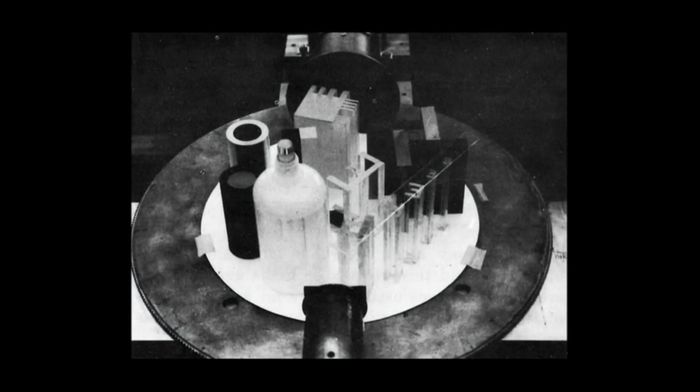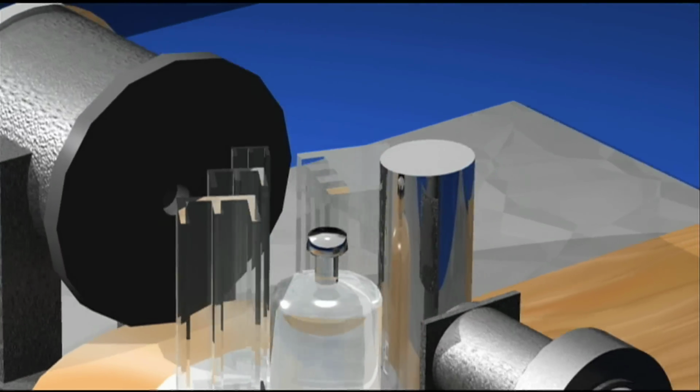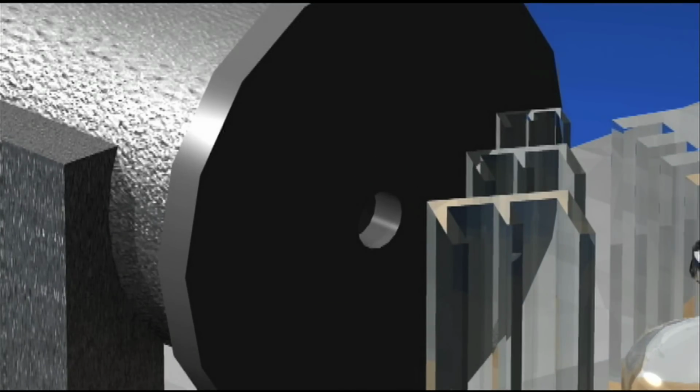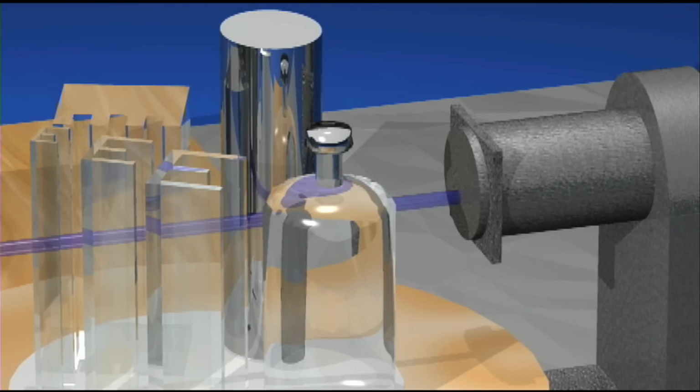With the theoretic feasibility of CT scanning, Hounsfield built this first prototype in the late 1960s. And basically what it consisted of was a lead box with a pinhole poked into the front. Inside of that box was a radioactive material, americium, and that provided a low-level constant X-ray source. Because of the pinhole, the radiation came out in a single collimated pencil beam configuration. That pencil beam would pass through the objects in the center, and that information, the attenuation, would be recorded by the single detector on the other side of that object.